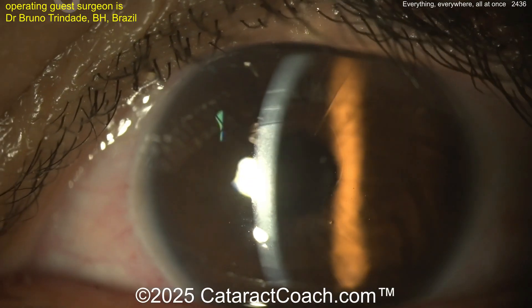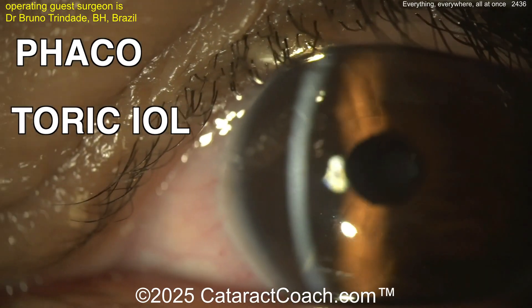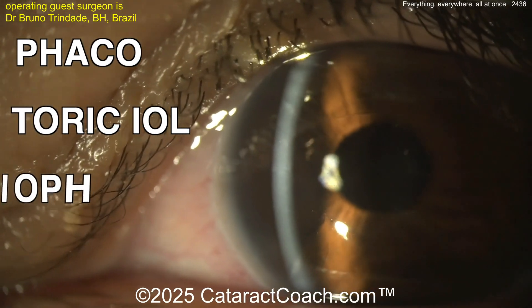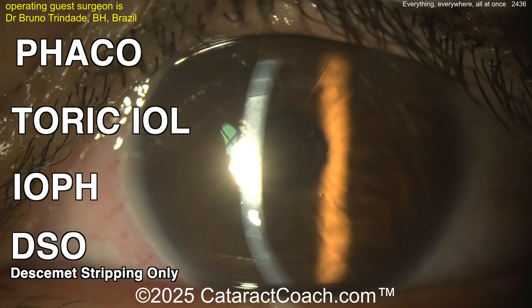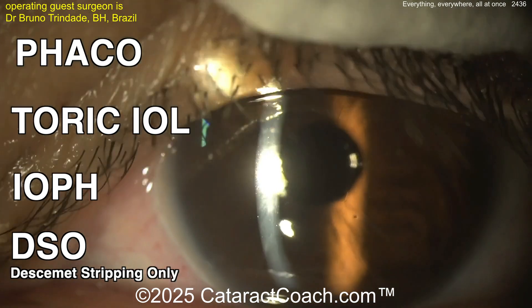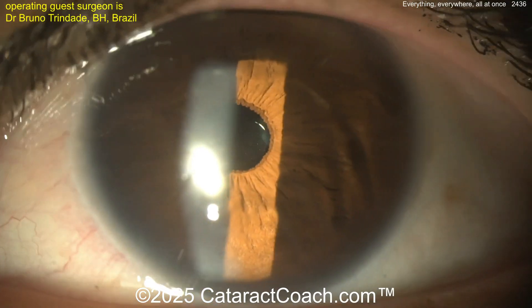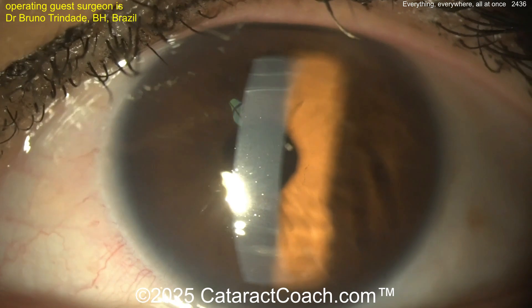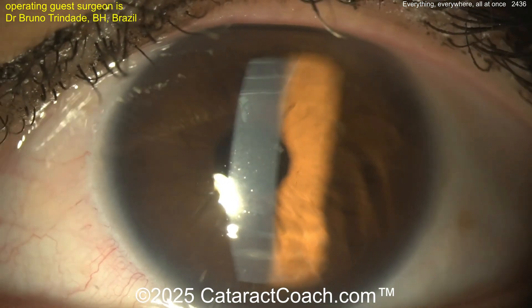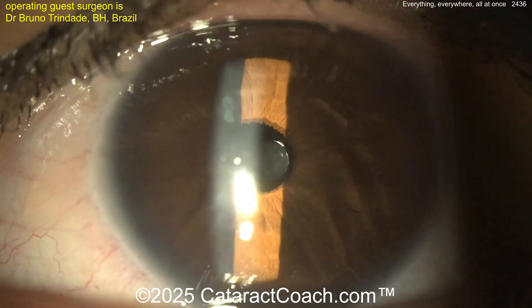So again, this patient had phaco plus a high-power toric lens plus the intraocular pinhole and DSO — Descemet stripping only — and wow, what a beautiful result. Patient incredibly happy — best this patient has seen in the entirety of their life. What a neat case. Sometimes you have to do heroic measures — do everything everywhere all at once.